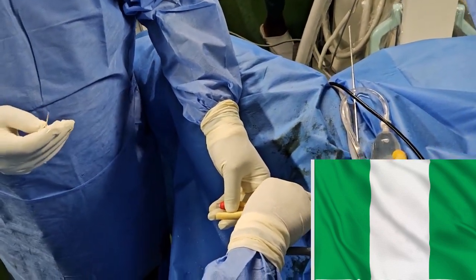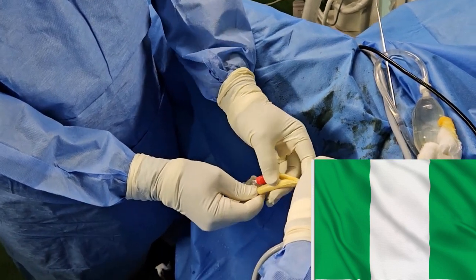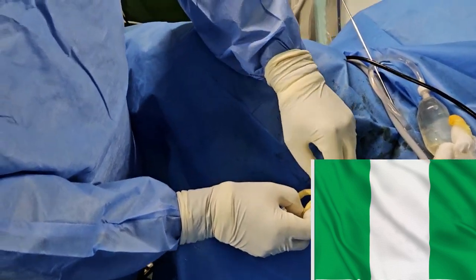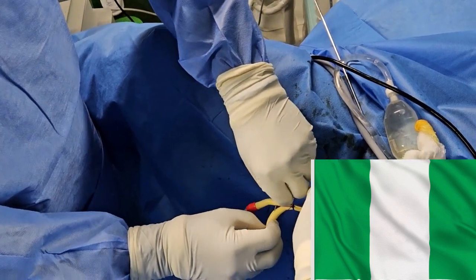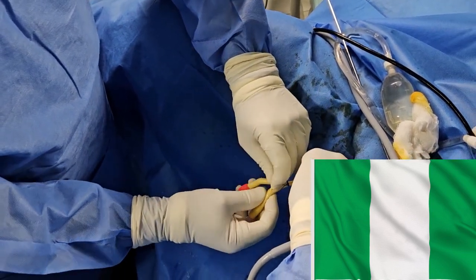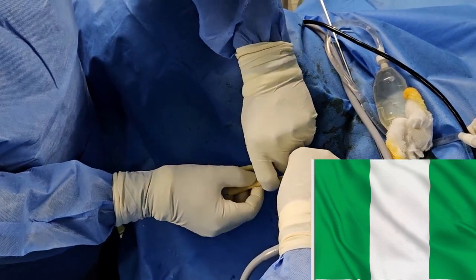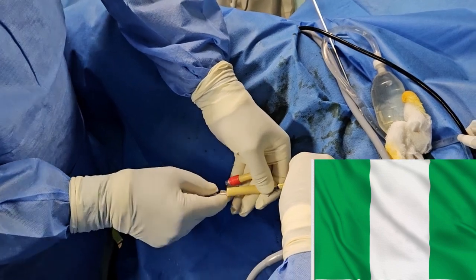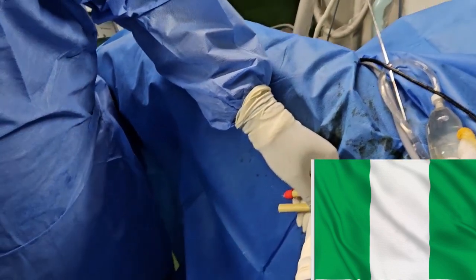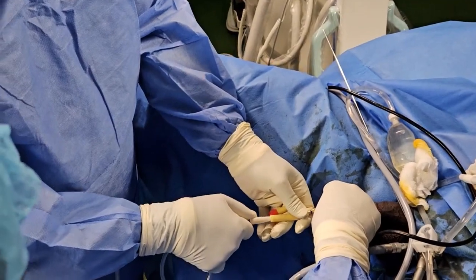So he's trying to pass the ureteric catheter through the Foley. So there's a trick here. The catheter goes through the Foley so that there's one drainage. You don't want the ureteric catheter leaking from the other side. Yes, sir. Exactly. So he passed the ureteric catheter through the Foley into the outlet so that he can attach a urine bag, right? Yes, sir. Exactly. And avoid falling in the wrong place. Makes a lot of sense. Quite innovative. I like that. So, urine bag. Still, there are innovations actually.